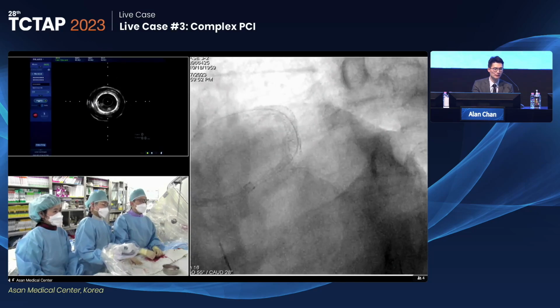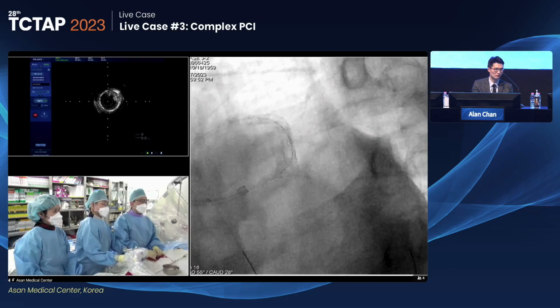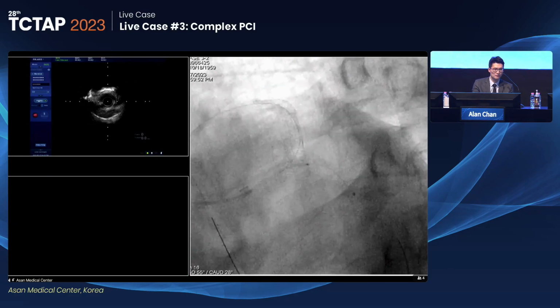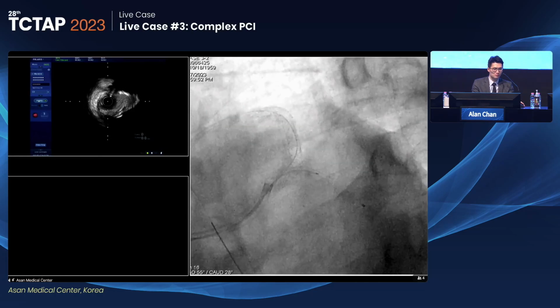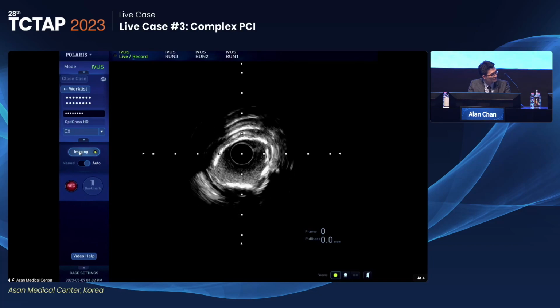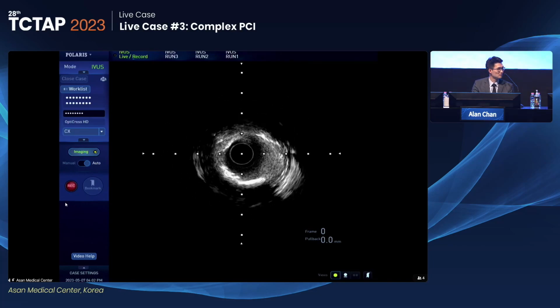I occasionally encounter similar scenarios. We did a very decent job of PCI again, but patients usually come back very soon, maybe within a year or less than 6 months. And then next time, come back with very aggressive ISR again with bifurcation tight lesions. So, is there any value in finishing the LAD with a drug-coated balloon? Or do you think the underexpansion dooms this stent?